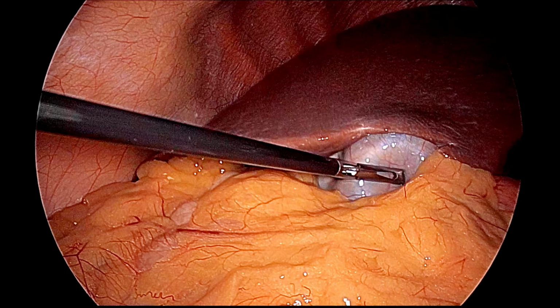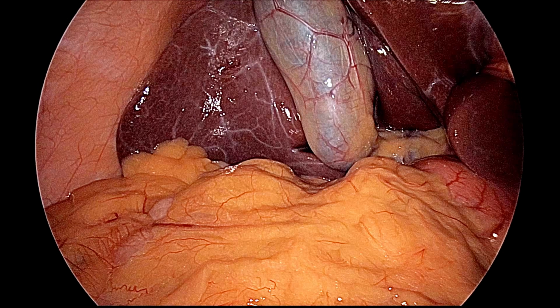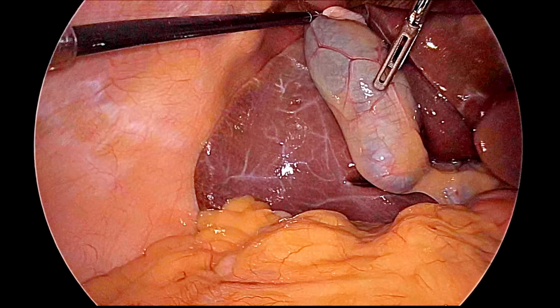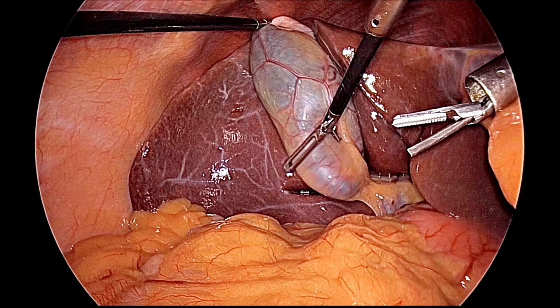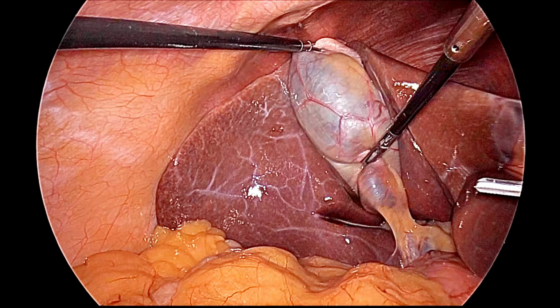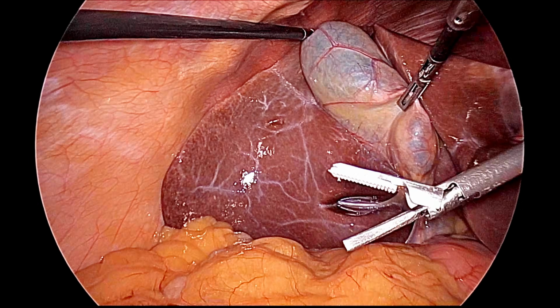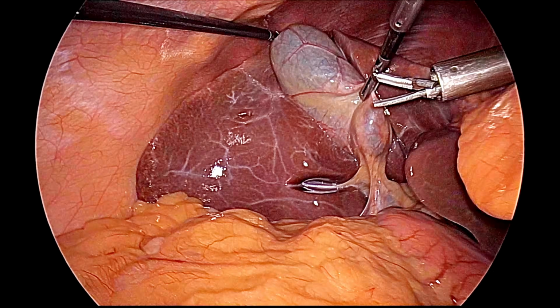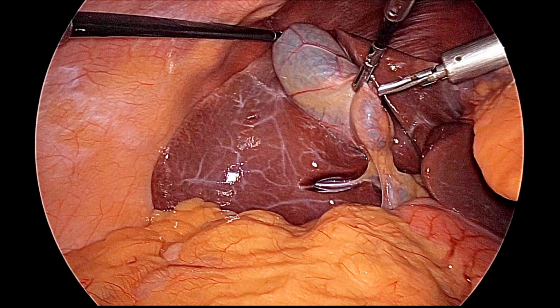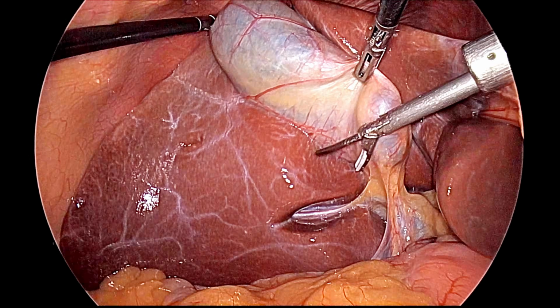The first step is we should hold the fundus of the gallbladder and retract it towards the right shoulder. After that, we will hold the Hartmann pouch with the left hand and then do the initial dissection. You can see Rouviere's sulcus is clearly visible, and all our dissections should be above Rouviere's sulcus. Here we are using the harmonic scalpel and the Teflon jaw of the harmonic scalpel will be towards the gallbladder. Below you can see the CBD, this is Hartmann's pouch, this is Rouviere's sulcus.